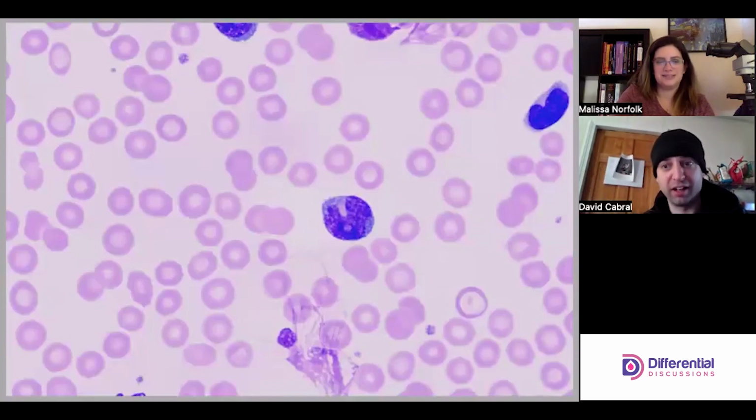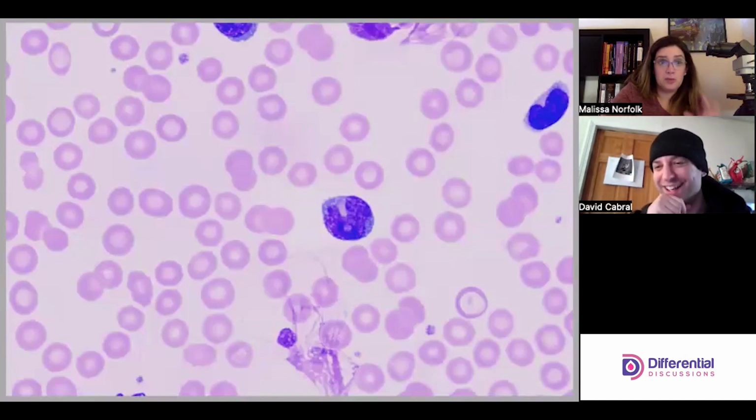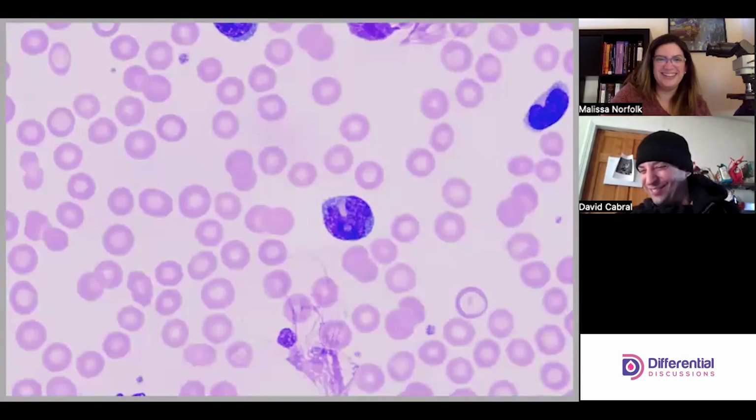So this is probably more like our prolymphocyte, and I see a pretty prominent nucleoli in the nucleus there. Given the history and everything, I'd be comfortable calling this a prolymph. But I think it's kind of in between a prolymph and a lymph, because the nuclear material looks a little bit clumpier than the pro we saw before. Agreed. The nucleoli is very prominent and large, but I feel like it's starting to close up. It could be either a prolymph or lymph, but the point is, not a mono. Very much, and that's a tricky call. That's a good cell though.